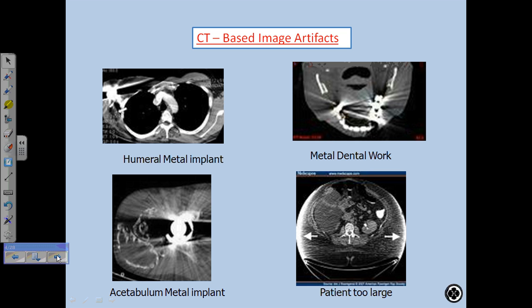Okay, so there is some information. They get this information from other views. I don't know how it really works. They gave us a talk, and I kept asking questions, and the physicist really didn't answer my questions. But what I got from the answers she gave me was that it uses other views to get the data about what's on this side of the humeral head, and so it really reduces the shadowing effect.